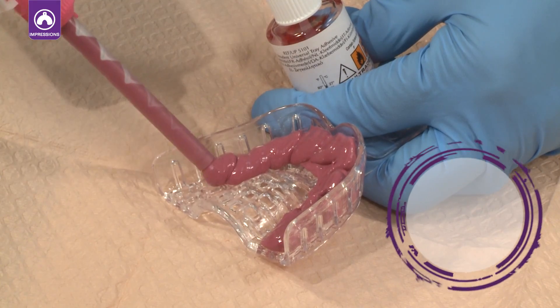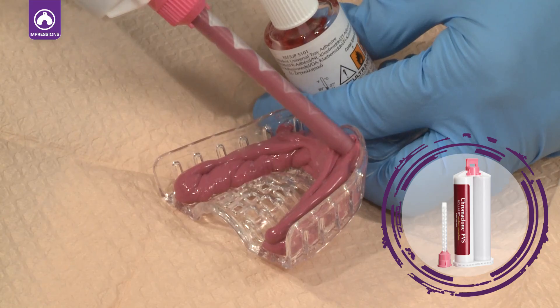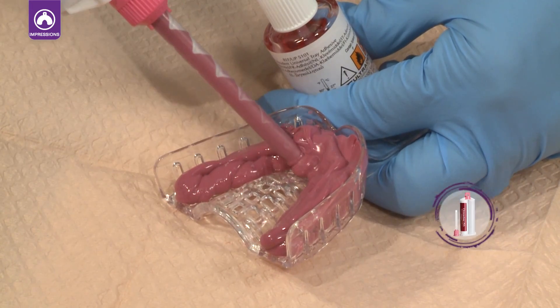Fill the impression tray with Chromaclone PVS heavy or medium body. Make sure to not lift the tip out of the Chromaclone, as this will introduce air into the impression material.